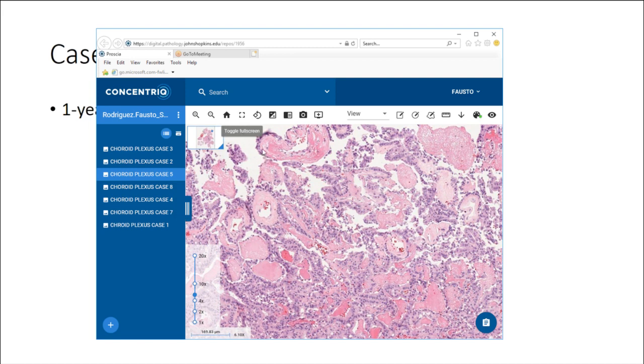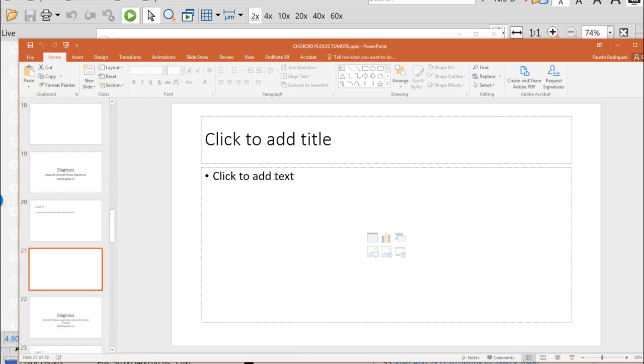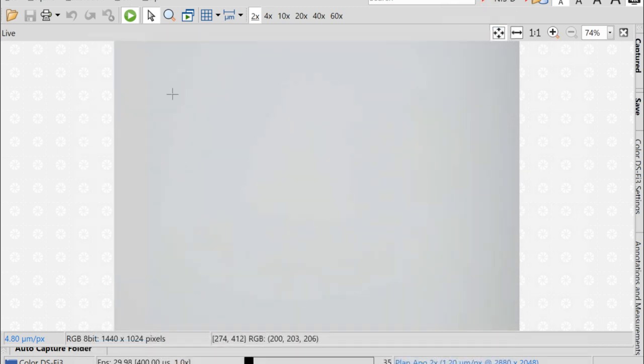Okay, but we have some slides here for this one.